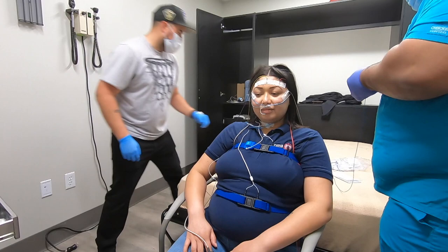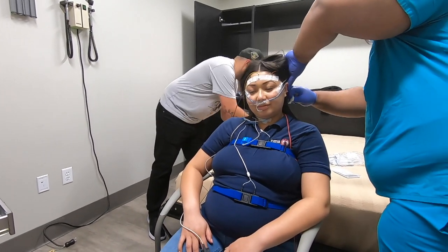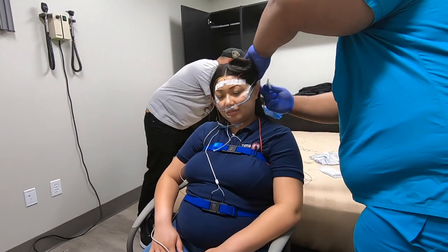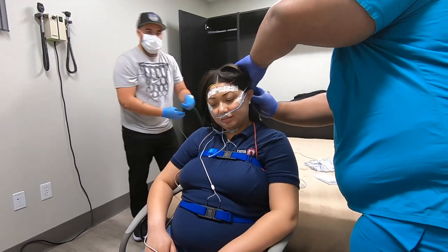So you have the nasal flow. What the belts do: if the belts are moving and there's no breathing, we know it's an obstructive apnea because she's still trying to breathe as the belts are moving. If the belts are not moving and there's no breathing, we know it's a central apnea because she's not even trying to breathe.